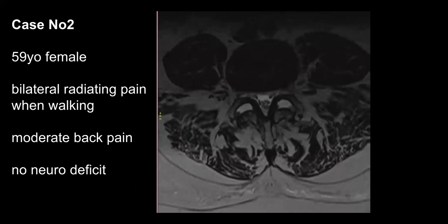And look, I agree with Andrew 100%, but when I look at an MRI of a patient like this, there's the obvious facet effusions and potential instability, but you look at that patient's multifidus as well. You look at the quality of their posterior spinal muscles. I presume they haven't had past surgery there. That is not normal, what you're seeing on that patient's spine. Those muscles are not that functional. The multifidus is completely replaced by fat at the L4-5 level. Now, that can be a bit more normal to see a bit of marbling at L5-S1, but you don't want your back muscles looking like a Wagyu steak, right?